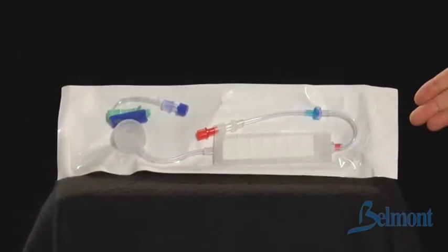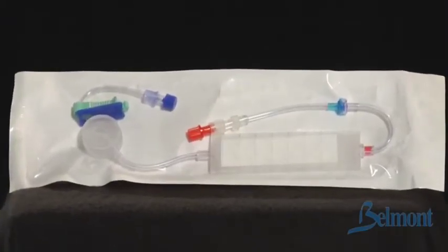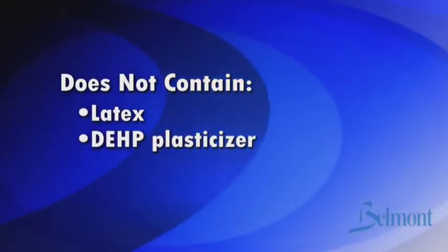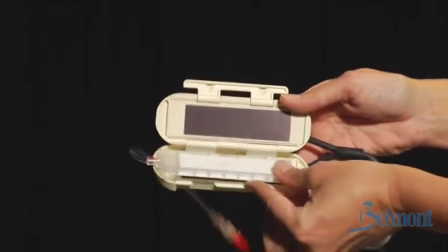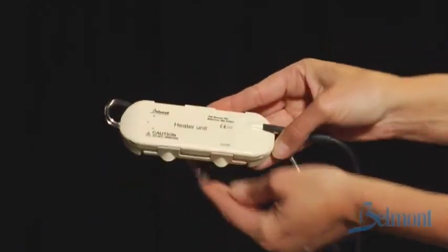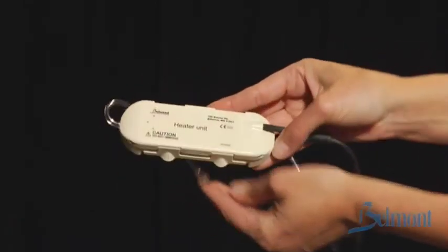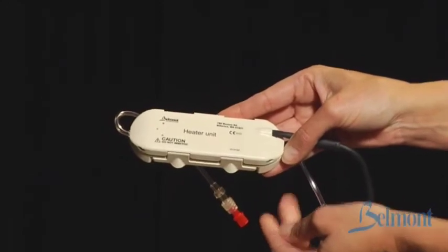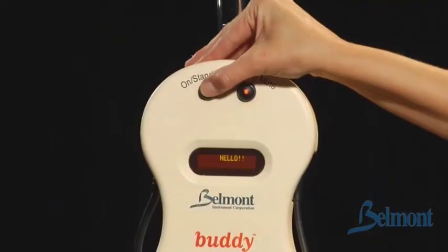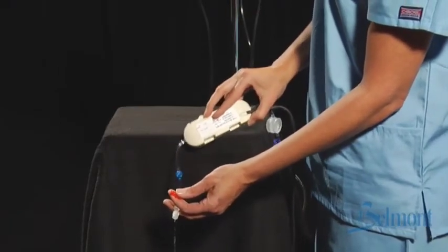Each disposable is packaged individually in a sterile pouch and is intended for single use only. It does not contain latex or DEHP plasticizer. Line up the red arrow on the disposable unit with the red arrow on the heater unit and snap the disposable into place. Close the latch on the heating unit — it should close completely without using force. Turn the power on. Flush the disposable with the fluid and tap, making sure you have removed all air, then connect the patient line.